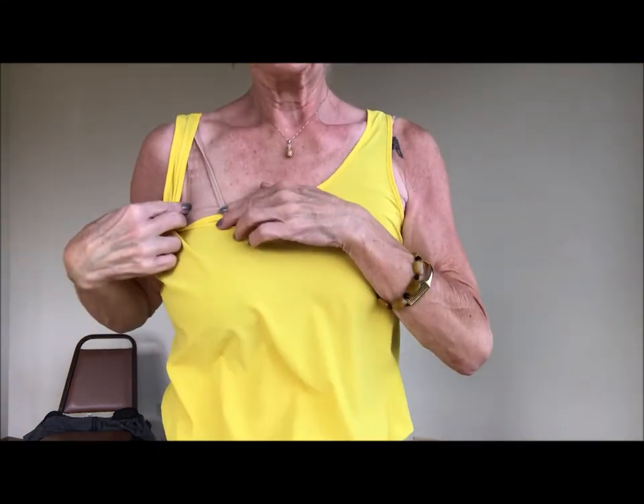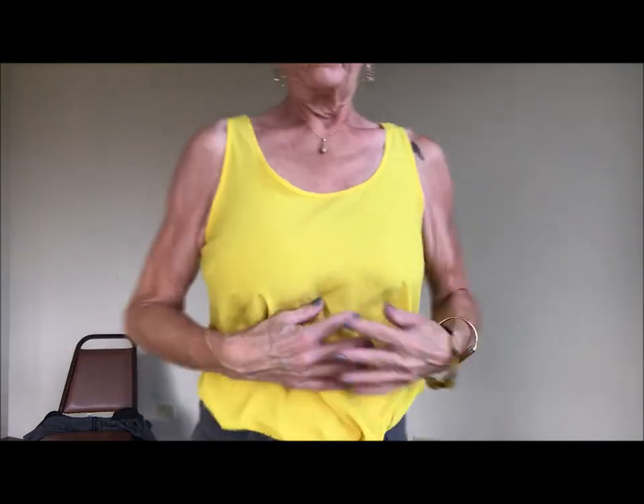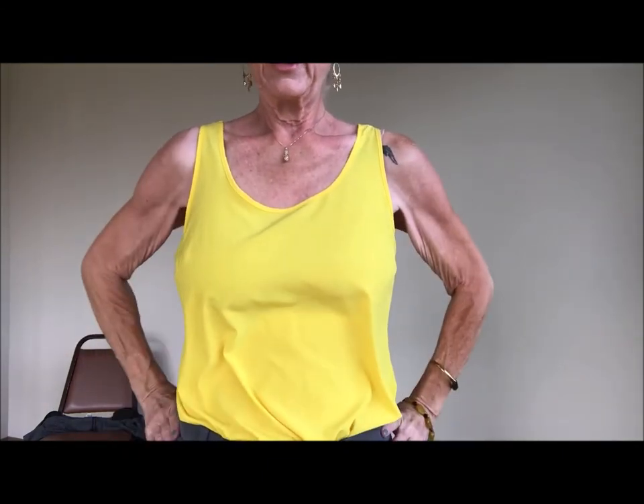If you have any questions or there's anything you want me to talk about, go ahead and comment down below. So this is the sports bra — I just wanted to show you how I start off. What a difference! So that's the sports bra, now we'll go to the prosthetics.